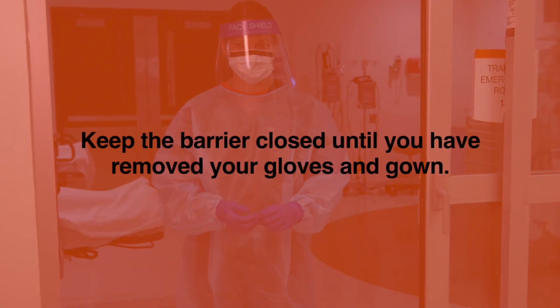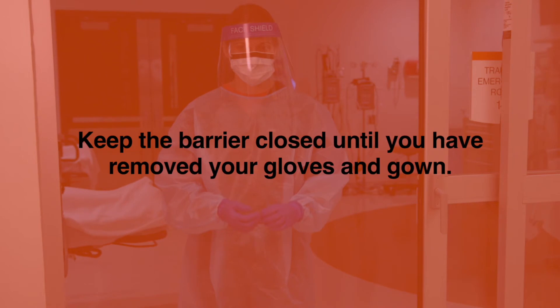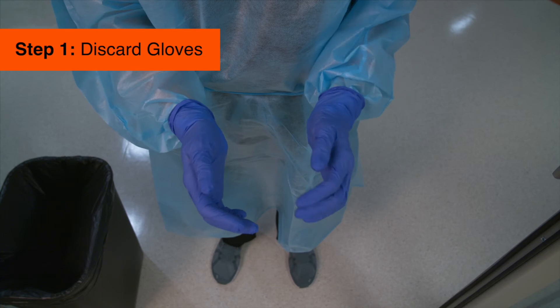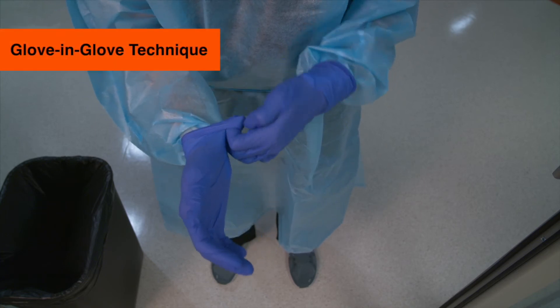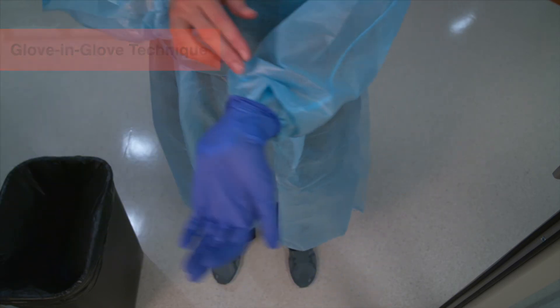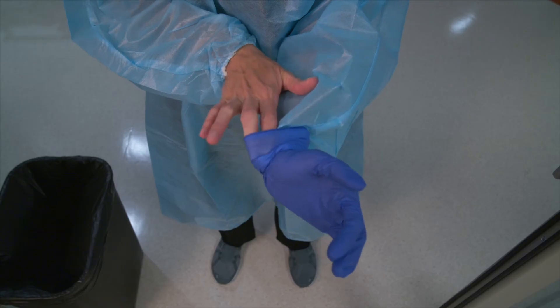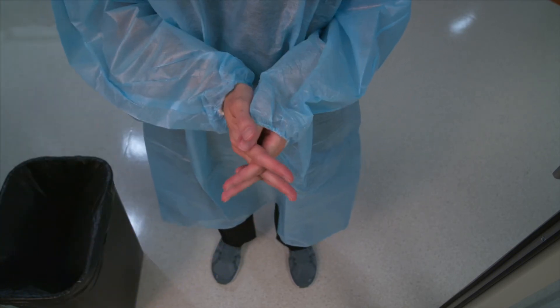Before leaving the patient's room, remove and discard your gloves. We're showing the door open for better viewing on the video, but in reality you'll want to keep the barrier closed until you've removed your gloves and gown. Gloves can be removed using more than one technique. For the glove-in-glove technique, pinch the outside of the glove near the wrist, peel downwards pulling the glove inside out. With your ungloved hand, slide your finger under the wrist of your remaining glove, again peel downwards turning the glove inside out, then discard the gloves.